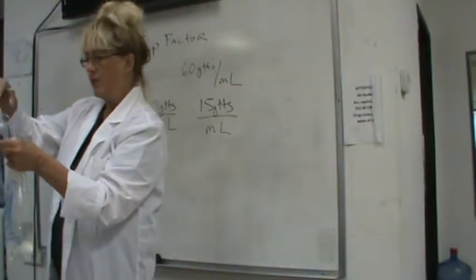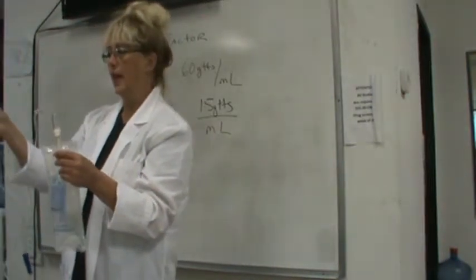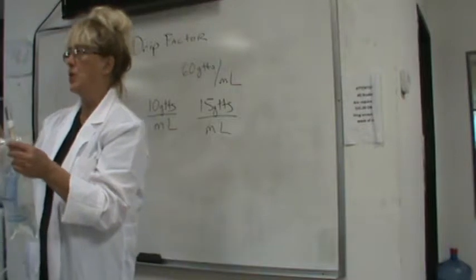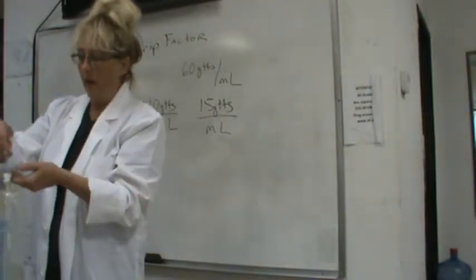And now what we're going to do is the following. The cap at the bottom should still be on. Just loosen. Don't take it off because this is sterile as well. We don't want this to contaminate. We would put this inside of our IV we just started, right? Okay. So now you can let go of the other hand.